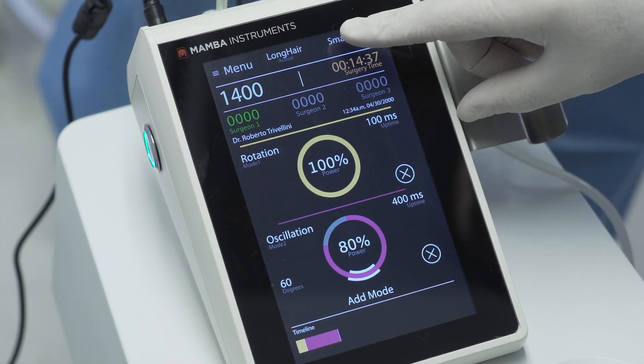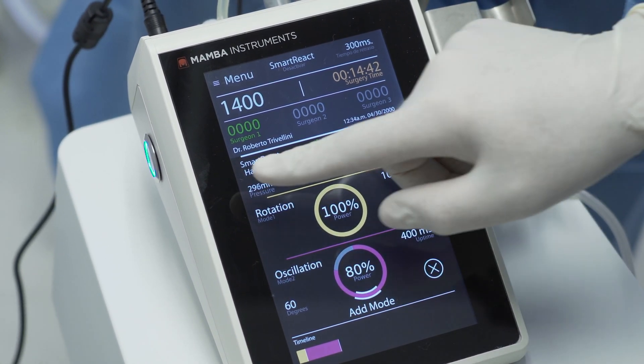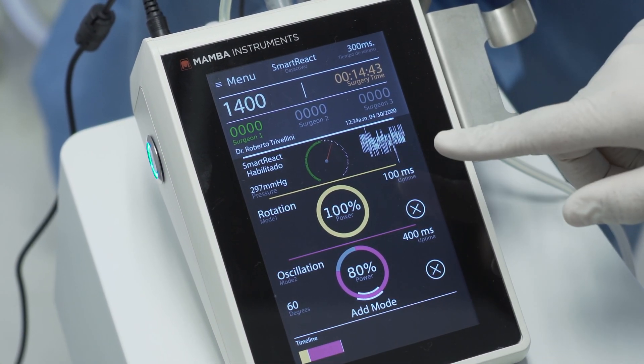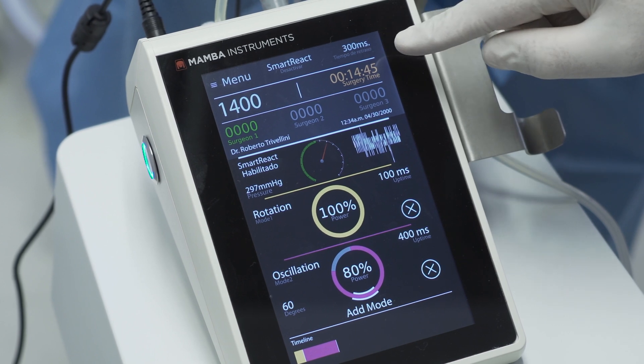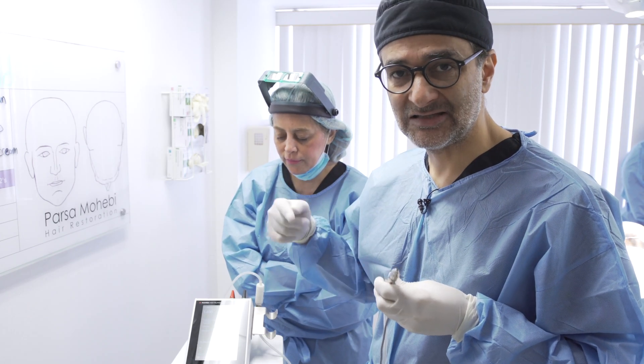To use the Smart React, you want to touch Smart React on this corner. That changes your menu, gives you a bar down here that shows the pressures and everything, and then it gives you a number here.